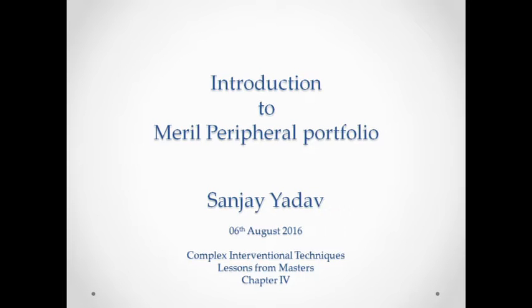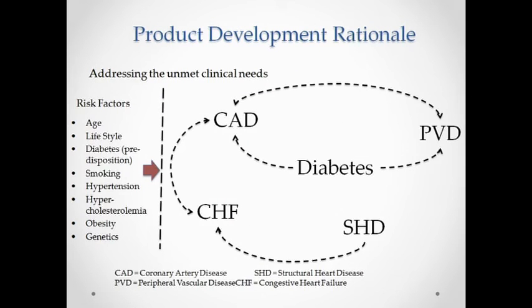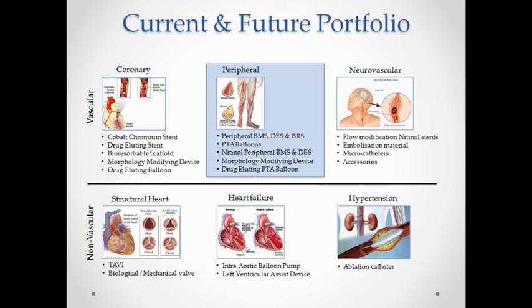We are at 4 atmospheres, going to 6, 10, going up to 12. We have gone up to 12 and we're going to deflate it. At this point, in the inflation, if there's any neurological problem occurring, we'll have to look at why very rapidly. In this territory, very important.